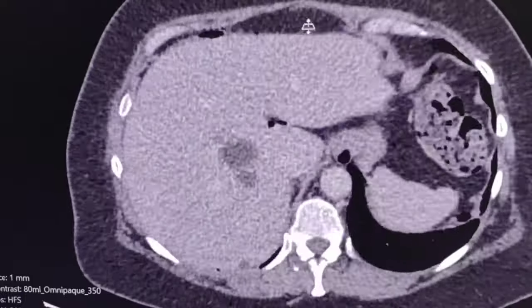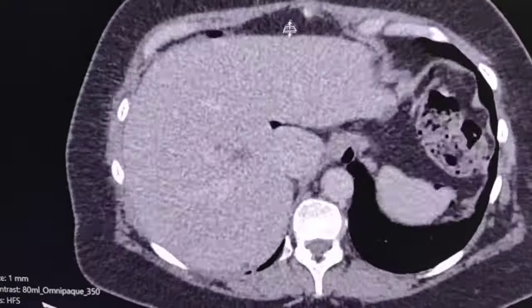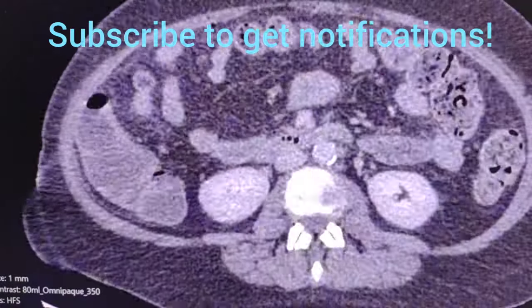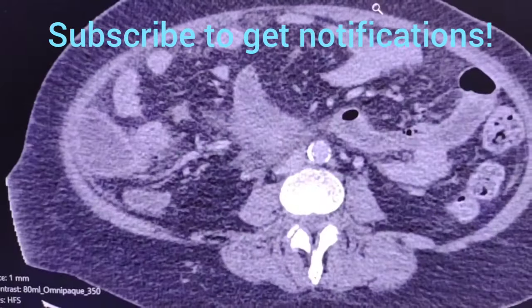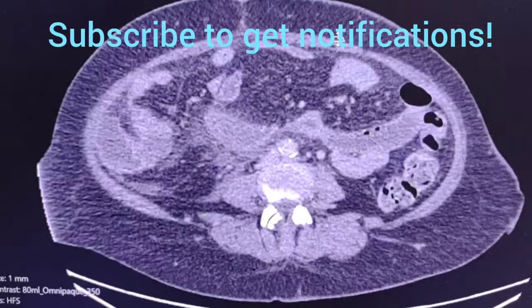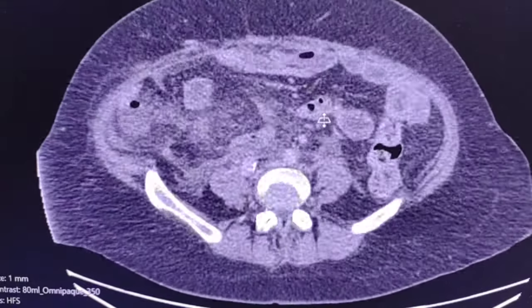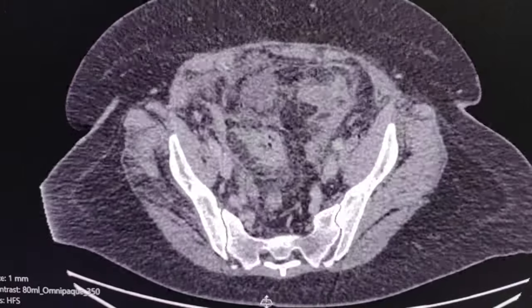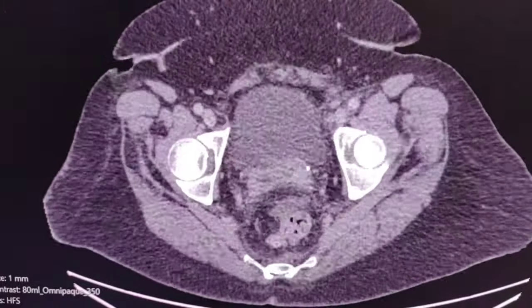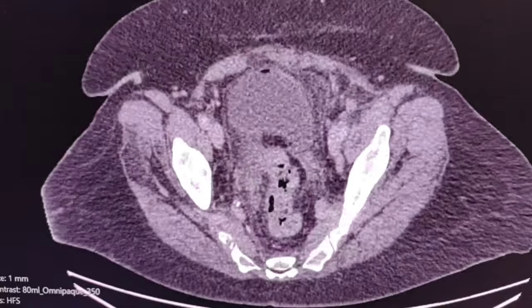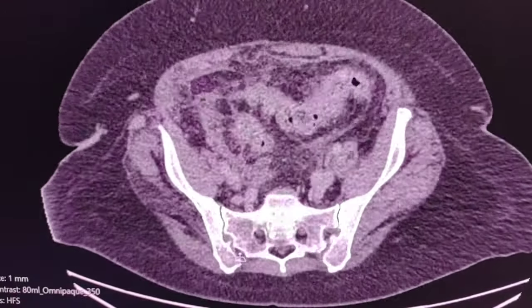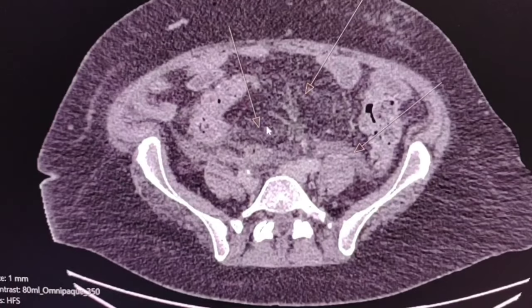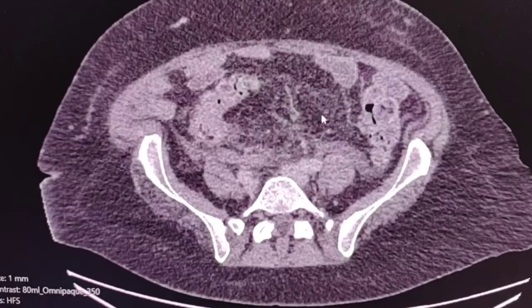There are multiple cysts in the liver which are chronic. Scrolling the images down, first of all there is a generalized blurring of the intraperitoneal mesenteric fat. There is fat stranding everywhere.